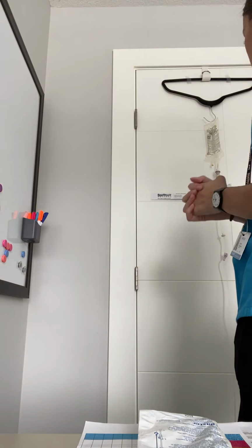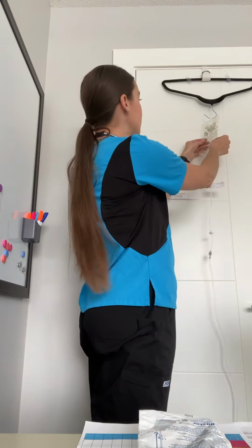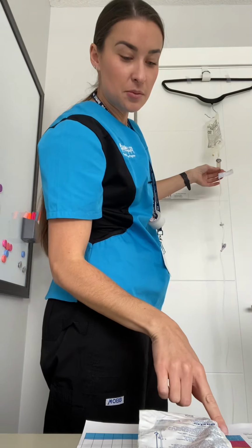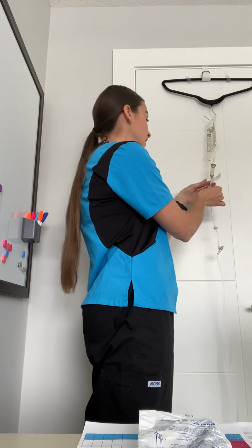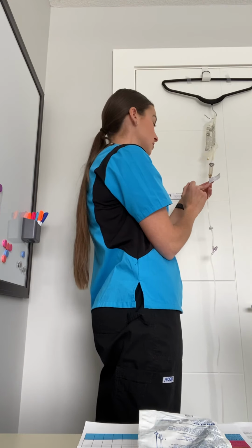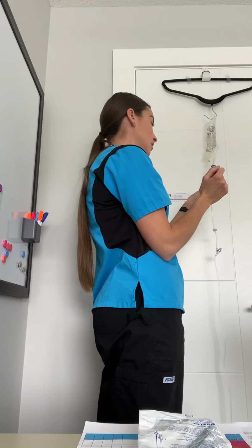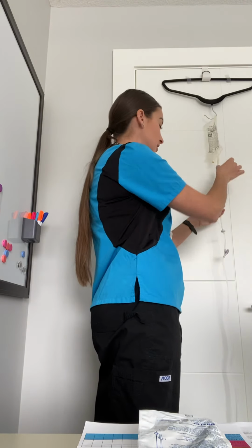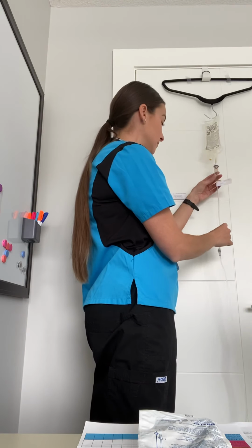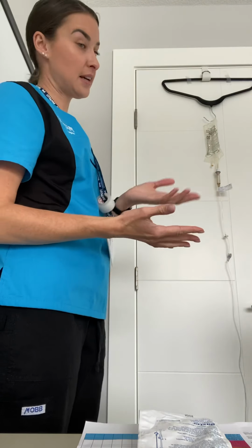Before I get started, I just want to check the actual IV line here. Maybe I'll switch sides. So we have 0.9% sodium chloride running at, let's see, it's supposed to be 10 milliliters per hour. Perfect. And we also have this primary line labeled here, October 21st, 2020 at 0800. So hung this morning, and it's normal saline, and everything looks good. No kinks, nothing. It looks like it's dripping and there's no air bubbles. So perfect. Then we also want to assess Allison's site.